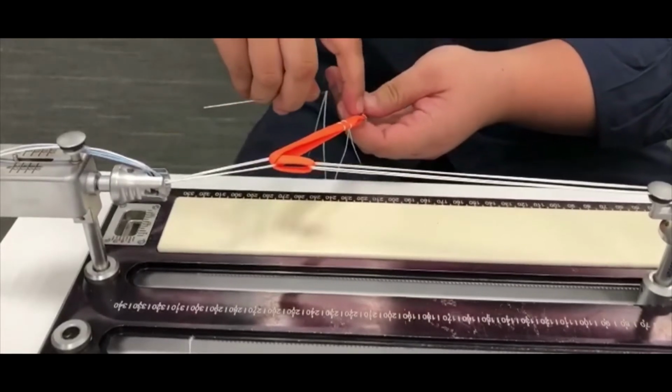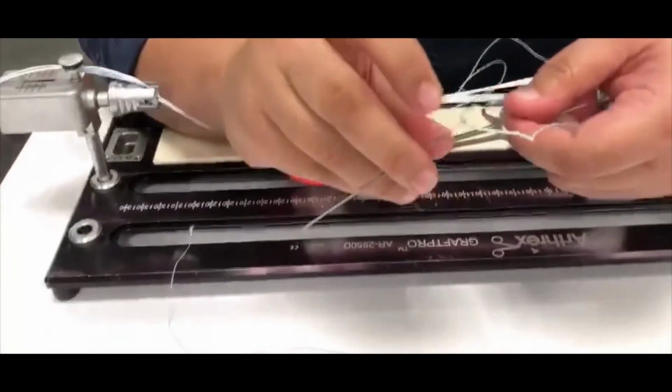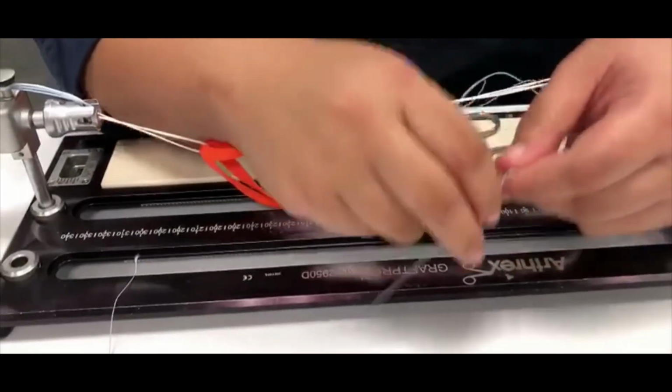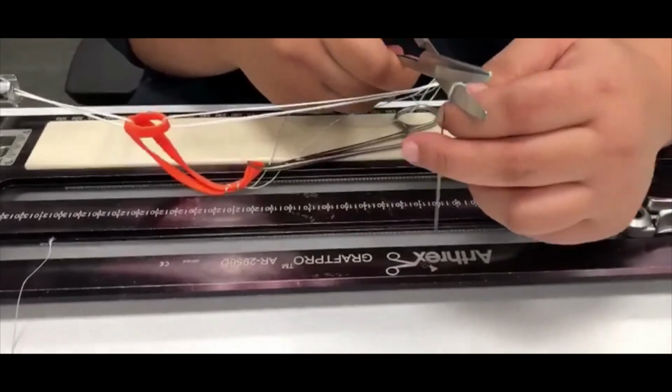to the end. Once you are done, see this part, you don't cut the metal loop, but you cut the sutures. Okay, just take a knife. A knife is easier.